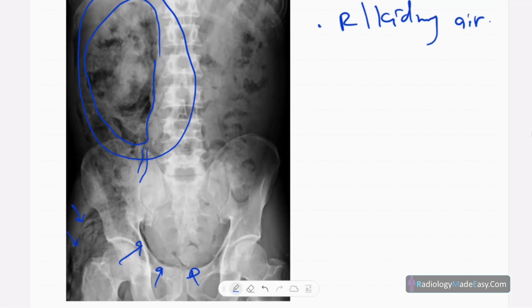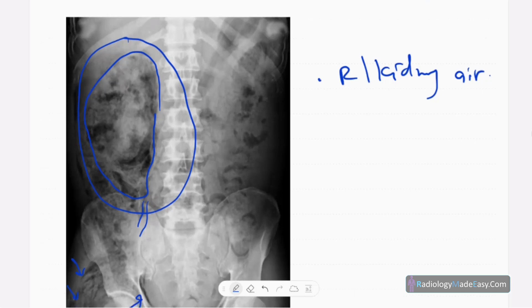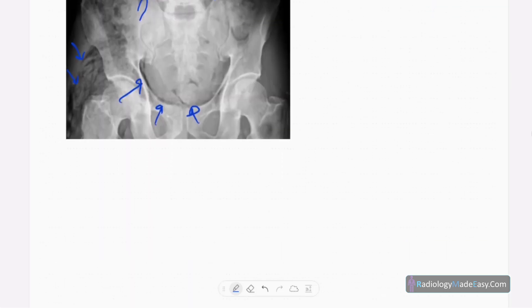There is subcutaneous emphysema — subcutaneous air and soft tissue air — so it's a kind of severe pathology. You don't see any free air within the peritoneum; no football sign within the peritoneal cavity. The air is in the retroperitoneum. There's no distension of the bowel loops to suggest obstruction, and the visualized bones are normal. The psoas shadow is unremarkable.